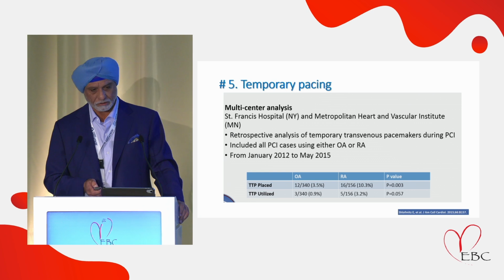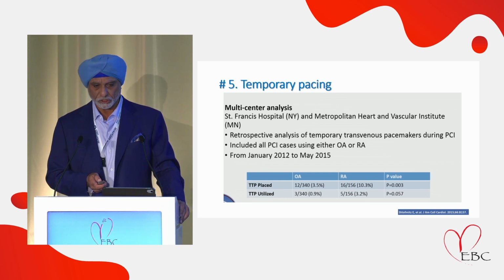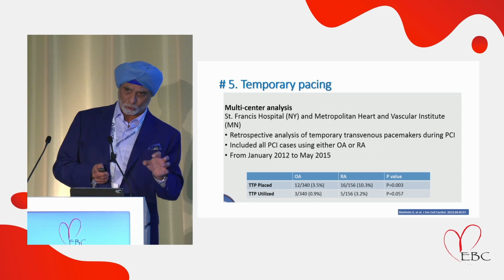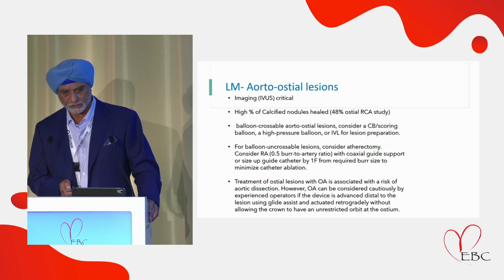Pacemaker need, obviously I use orbital a lot, and we really don't ever put in pacemakers, because there's no real need for them. The way it kills the red cells, adenosine is released. Rotational actually causes much more destruction of red cells with release of adenosine, not really the vibration sense, more adenosine release from the red cells, and more happens with rotational than orbital.